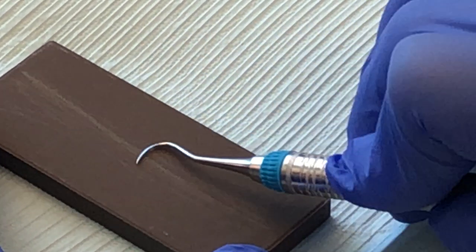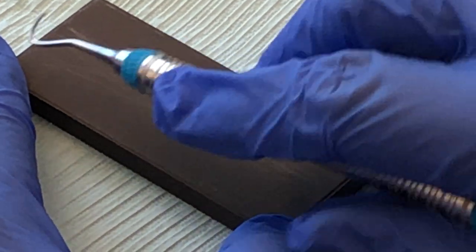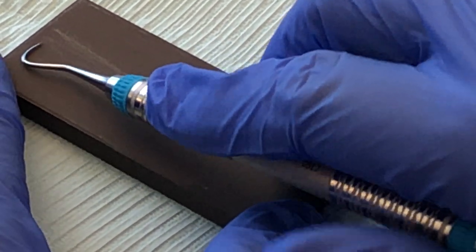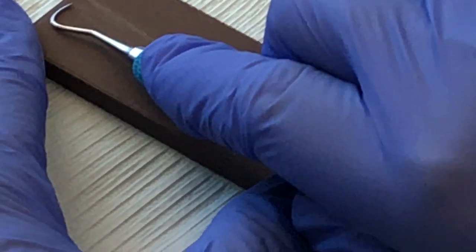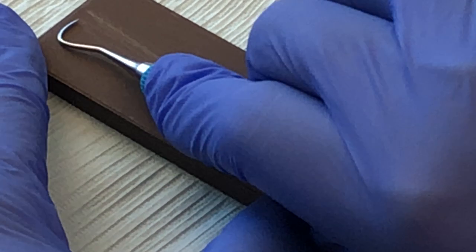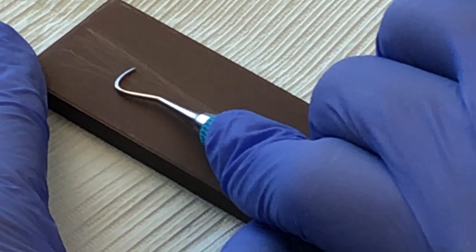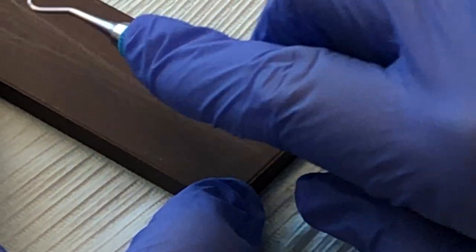The sickle has two cutting edges, so after that, turn it around. The toe of the instrument's headed in the other direction with the same process. Find the starting spot, pressure on the back of the blade, middle of the blade, and toe.